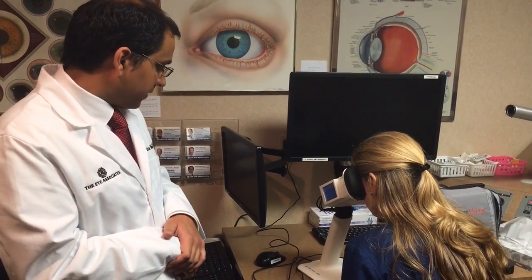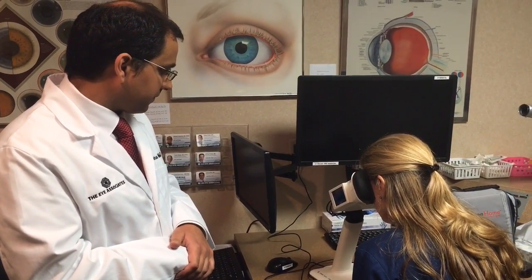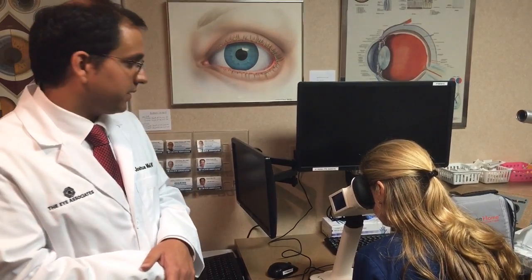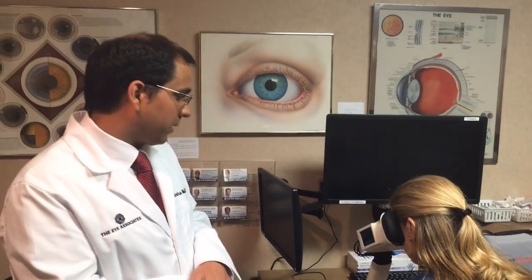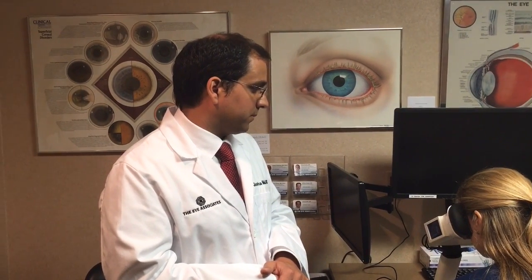This is kind of a demo. It's running through a little video showing you how to do it initially. The company is really good about talking with each patient — they send the machine to the patient and actually show them how to use it and explain how to use it. So it's very streamlined. Any patient, basically, it doesn't matter how old they are or if they have any medical issues like Parkinson's, for example — we're still sometimes able to get a good baseline test and monitor them with this machine. So it's a pretty universal machine for most patients.